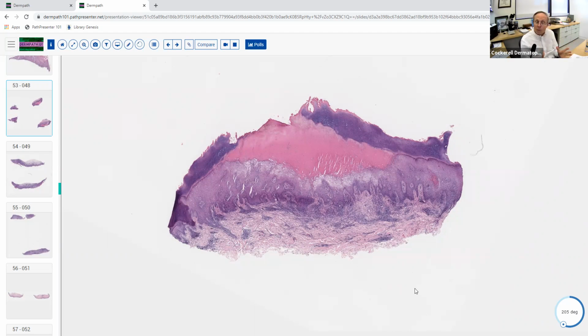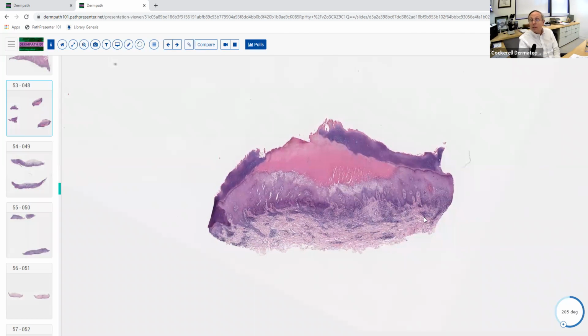Okay, and that's helpful. We don't use these clues just at random. They're helpful in making the diagnosis. So, this disease doesn't occur very commonly on the trunk or extremity. It almost always occurs on the hands, or rarely on the feet, almost always on the hands. So we've got an inflammatory process, low power lymphocytes here. See how black these are compared to the neutrophils in the previous one and the histiocytes? So we see that these are lymphocytes at low magnification.